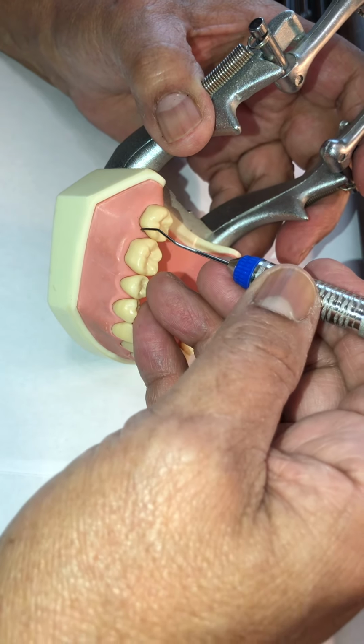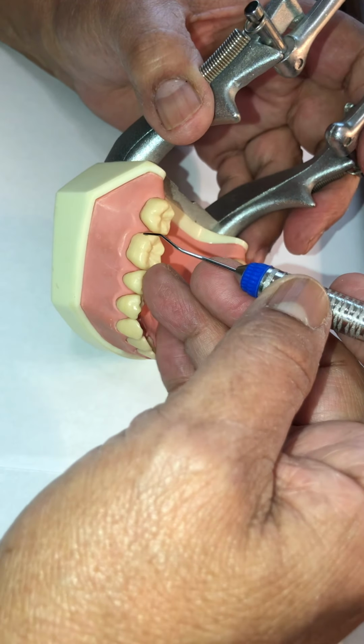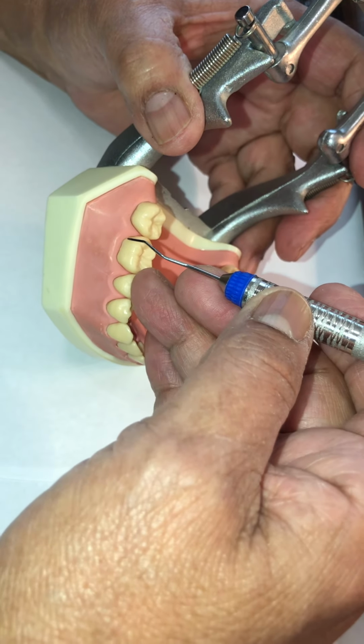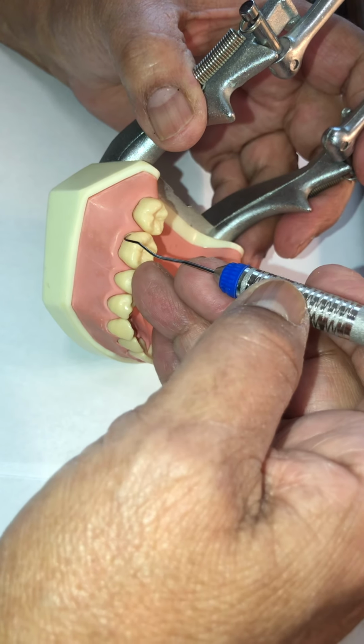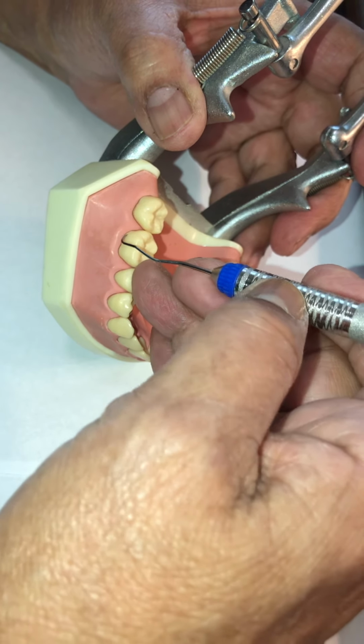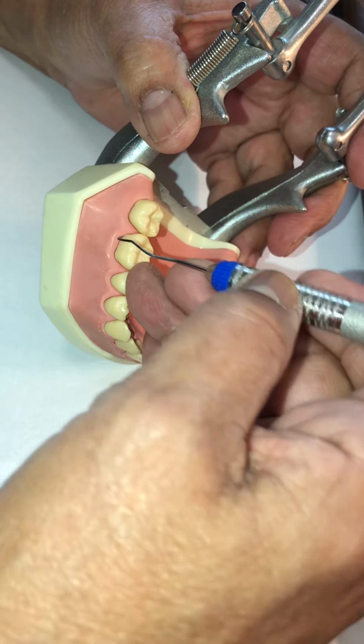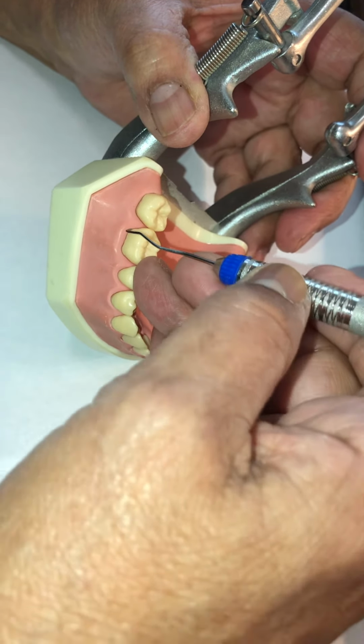So you stand it up between two teeth, okay? And this is how you determine. The terminal shank is standing straight up and down, okay? And I'm going to start with the lower third side of the tip, and I'm going to work it and walk it, using my wrist only, not my fingers, into the distal surface of that molar, and it continues to stand straight up and down. That's as far as I can get.